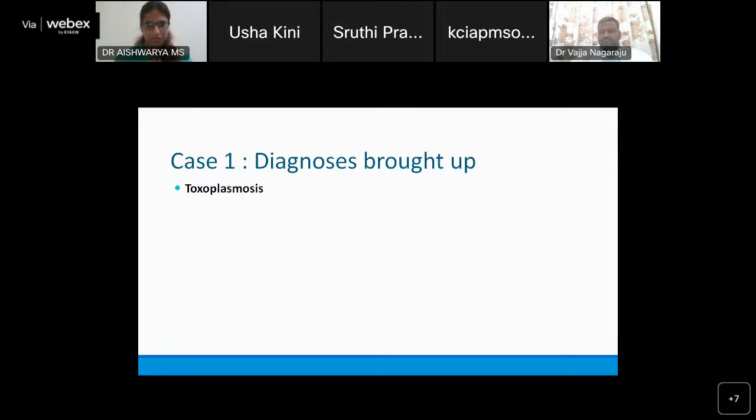And how would you then make a diagnosis of toxo? Ma'am, for toxo, we have to do PCR and ask about the history also, especially if they might be cat owners. That is an important history. And try to get a serology done. Serology. Okay. So it is just a suggestion. Probably it has to be figured out with more investigations.